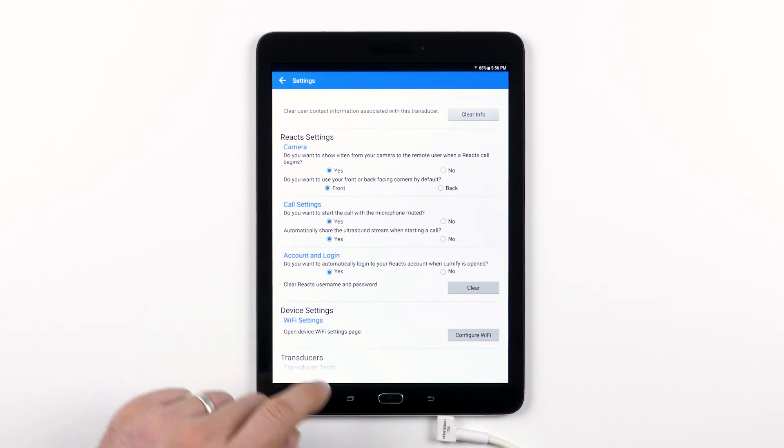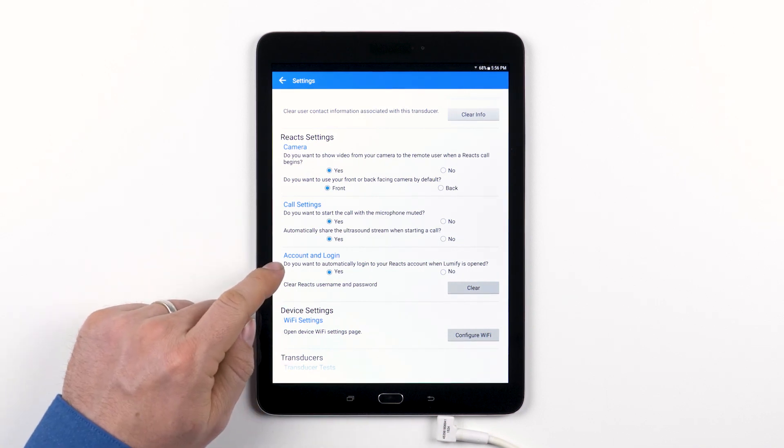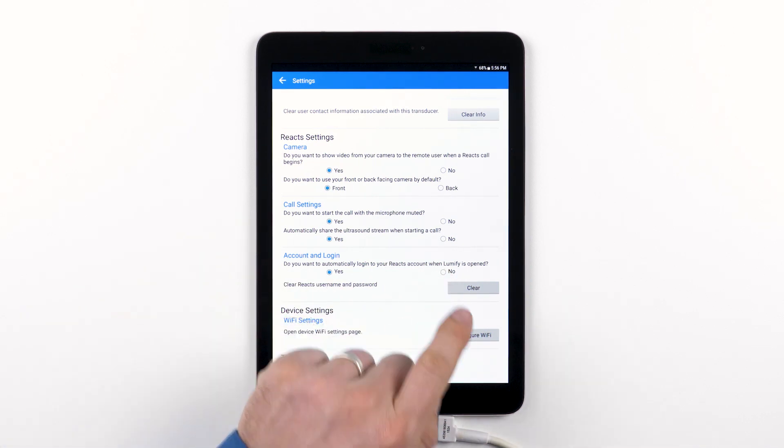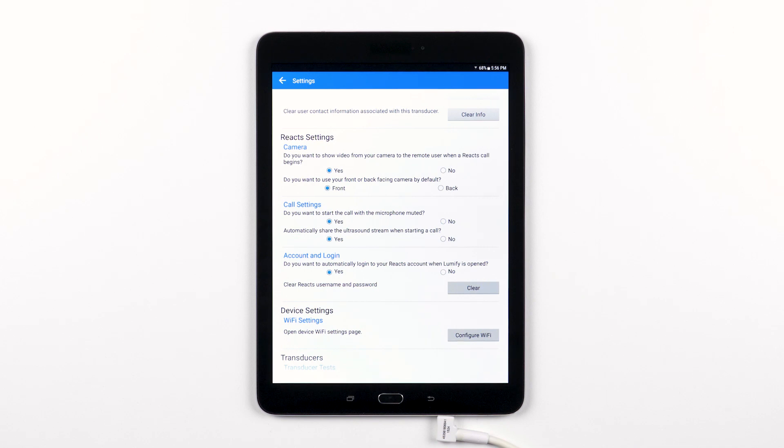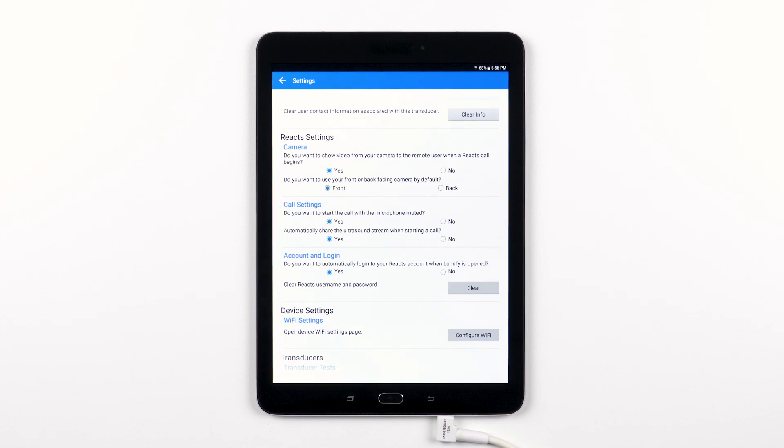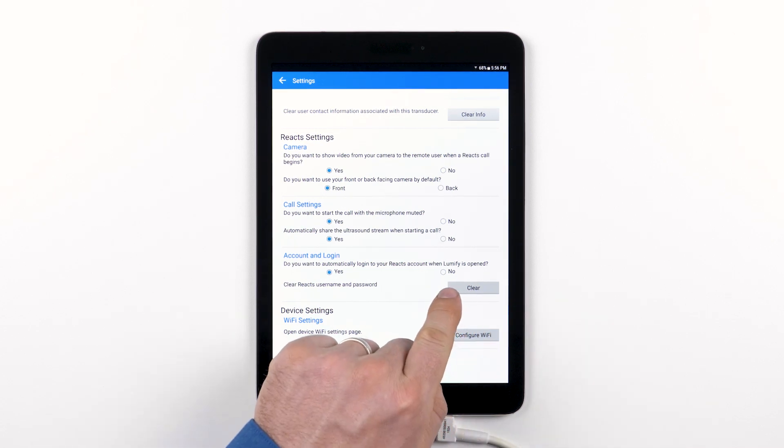You have the option in the account and login section, yes or no, to automatically log into your Reacts account as soon as you open Lumify. This essentially allows you to bypass the Reacts login screen each time you want to use the feature, and of course, you can clear any saved Reacts username or password in that section as well.